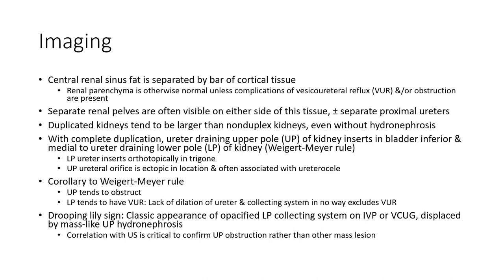With complete duplication, the upper pole ureter orifice is ectopic in location and often associated with a ureterocele. Corollary to the Weigert-Meyer rule: the upper pole moiety tends to obstruct, and the lower pole tends to have vesicoureteral reflux. Lack of dilatation of the ureter and collecting system in no way excludes a ureterocele. The classic 'drooping lily' sign: the opacified lower pole collecting system on IVP or VCUG is displaced by a mass-like upper pole hydronephrotic process. Correlation with ultrasound is critical to confirm upper pole obstruction rather than another mass lesion.